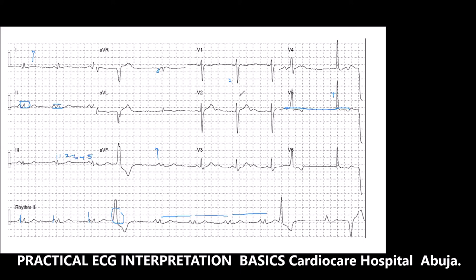And right ventricular hypertrophy, we already said is what? Once you have the R wave in V1, if you have it positive in V1, that is right ventricular hypertrophy. Remember, we talked about it already. Isn't life simple? ECG is simple. Does anybody have doubt? I have believers in the studio, but they are looking at me very cautiously.